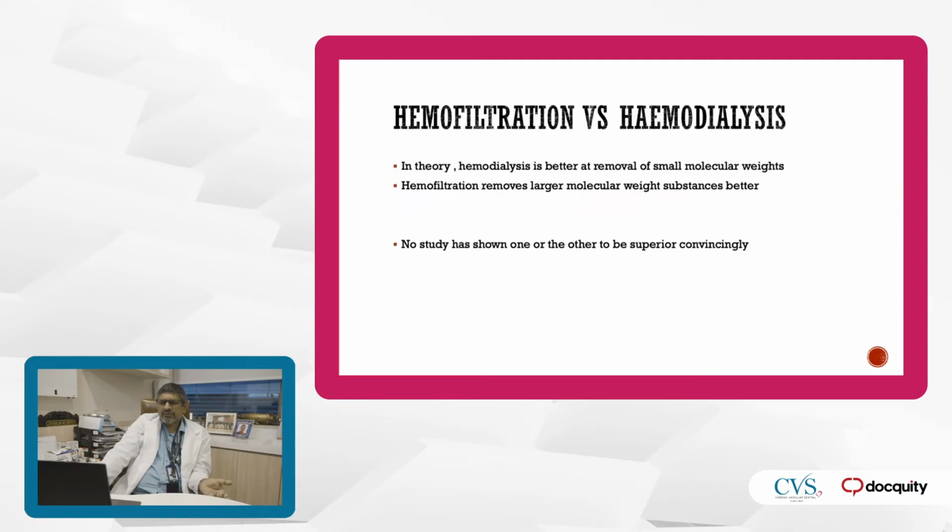So what's the difference between hemofiltration and hemodialysis? In theory, hemodialysis is better at removing small molecules. Hemofiltration is supposed to remove larger molecules better. But in real life, no studies have shown one to be superior to the other in a convincing manner.